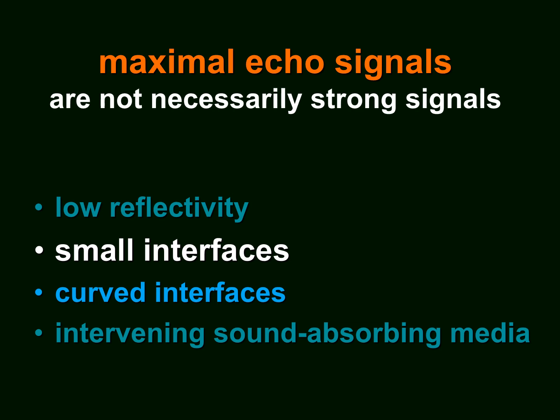Another reason that maximal echo signals may not be strong signals is the size of the interfaces. Small interfaces produce much weaker echo signals, even if they are maximized.